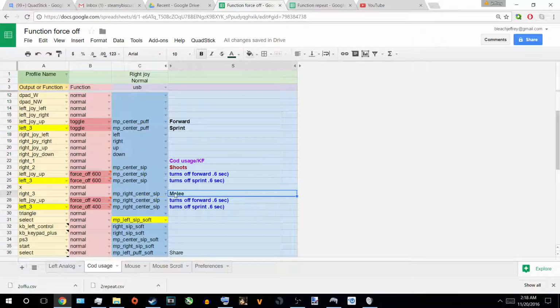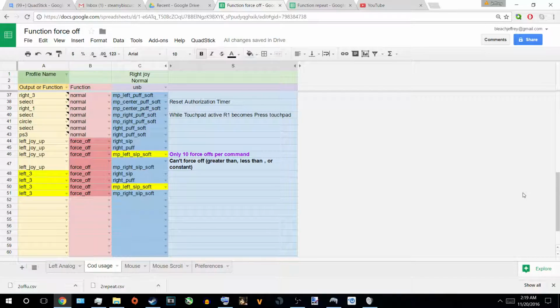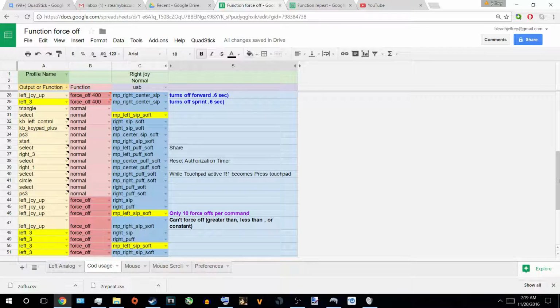And there you have it. That's really all the uses I have for it, but like I said, everybody's creative. Come up with your own way of using it, that'll be great. And right below it, if you notice, I do force-offs when I right sip the tube and when I right puff the tube, to prevent mistakes.